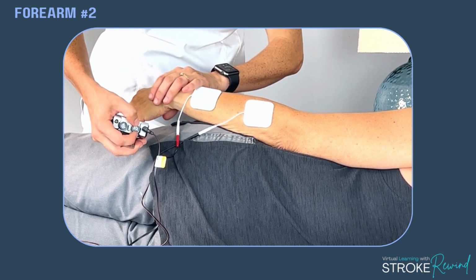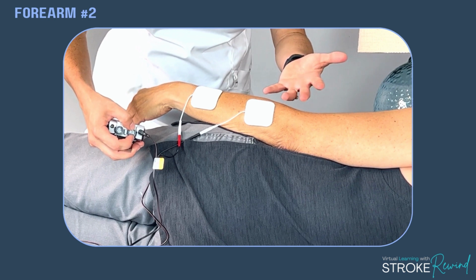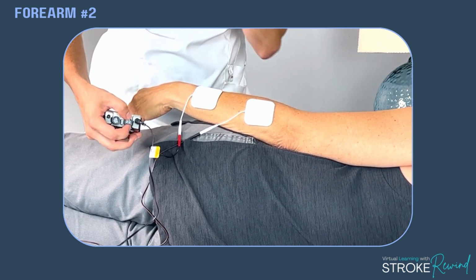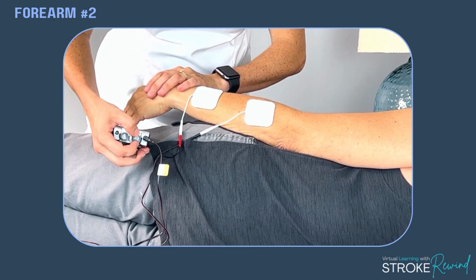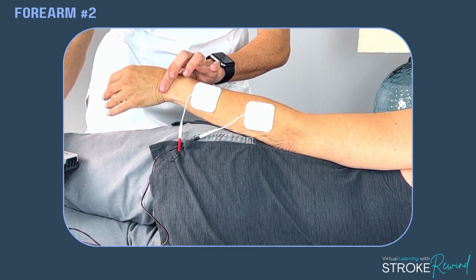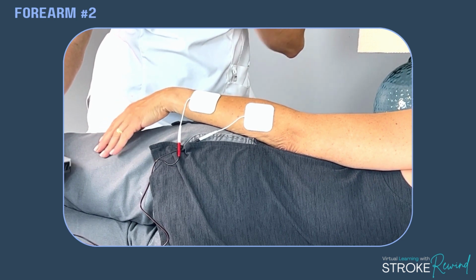I can feel it. Okay, and now that she can feel it, again, that's still incredible in itself because we're sending a feeling signal up to the brain to remind it about this movement of this particular muscle. But now what I'm going to do is move it up and see if I can get a movement. Oh, see this? Can you see her fingers moving? I am not moving it. She is not moving it. She is moving those fingers.